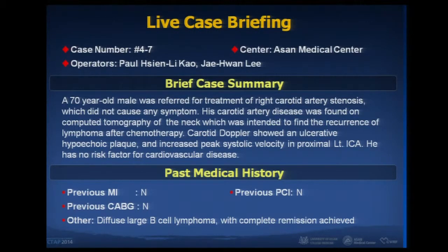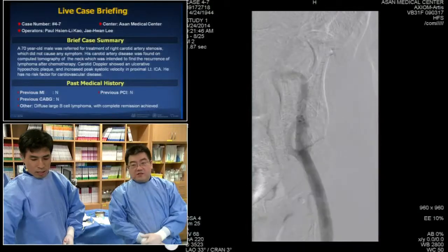And during the routine follow-up CT angiogram, right proximal ICA stenosis was visible 5 years ago, moderate stenosis, but it slowly progressed, and from 1 year ago, the region was very tight, so he was admitted to treat the region. Yeah, so the history is very interesting.